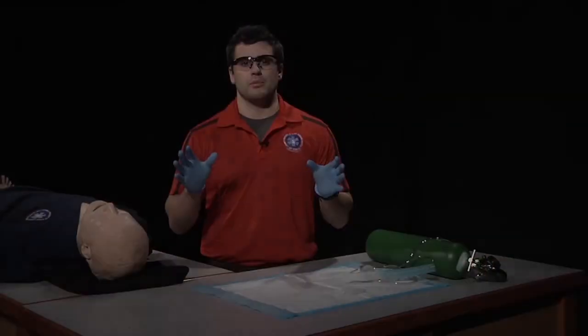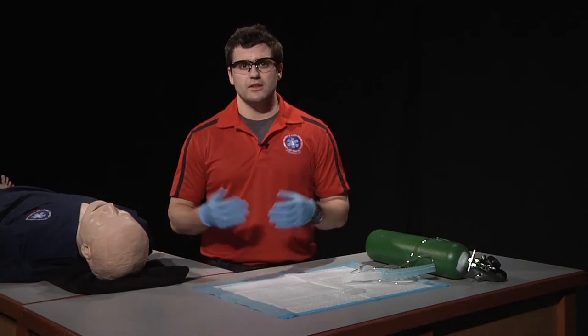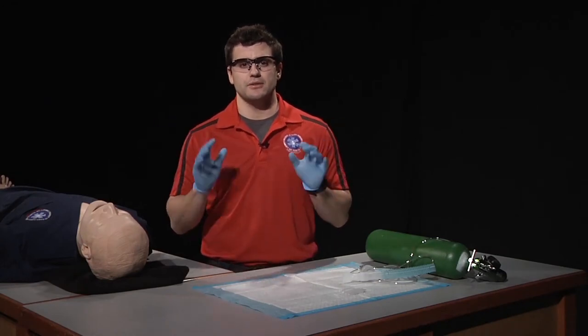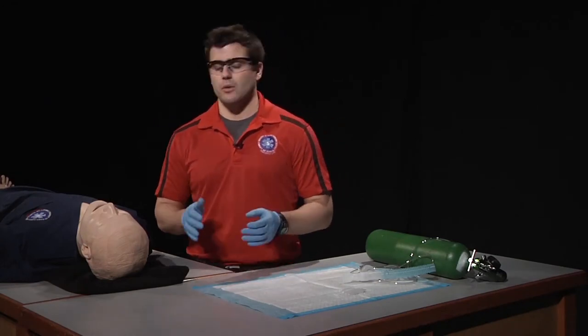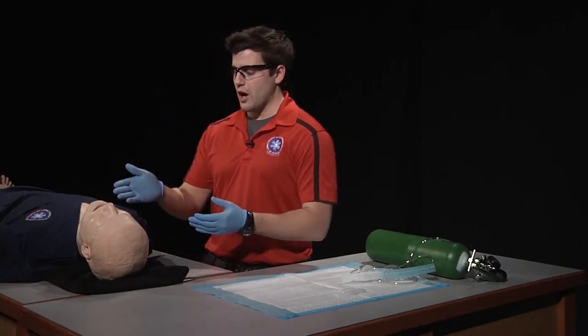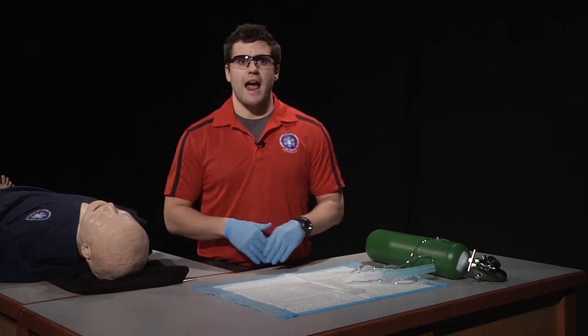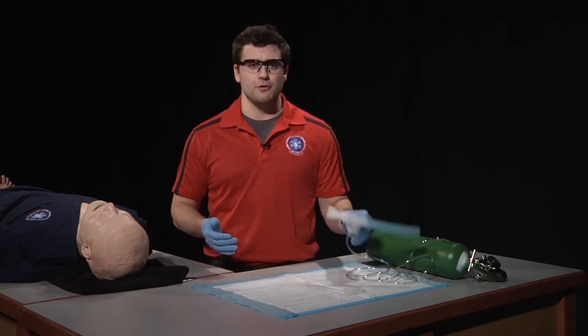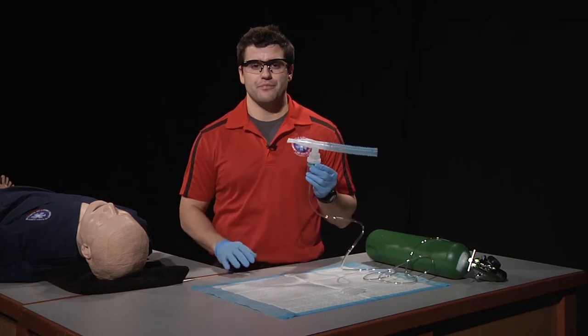Now it's time to don the appropriate PPE. For this skill, it's eye protection and gloves. From there, we're going to remove the oxygen mask from our patient and instruct them to firmly hold the nebulizing unit up to their mouth.